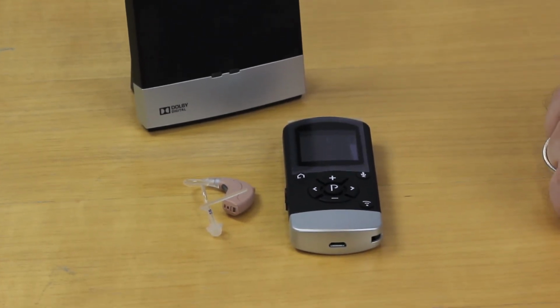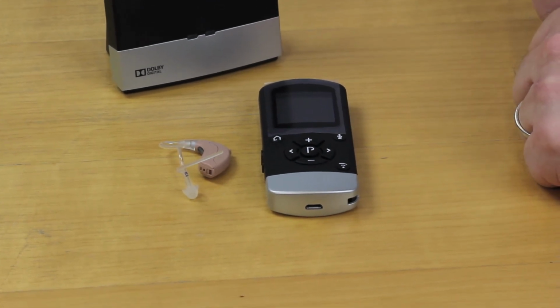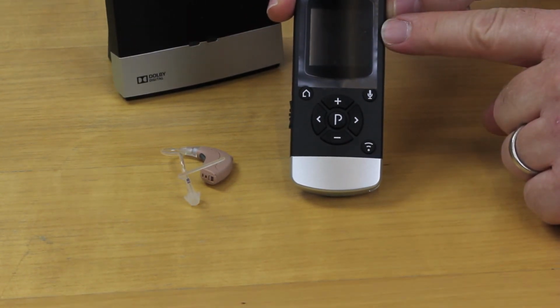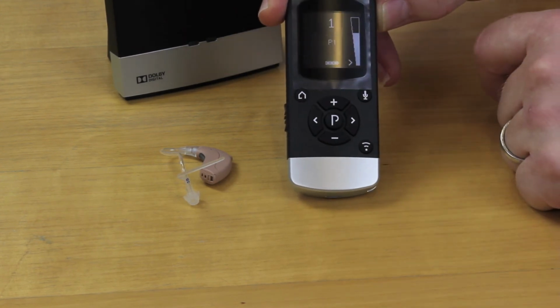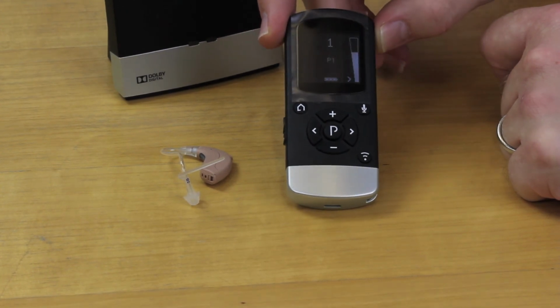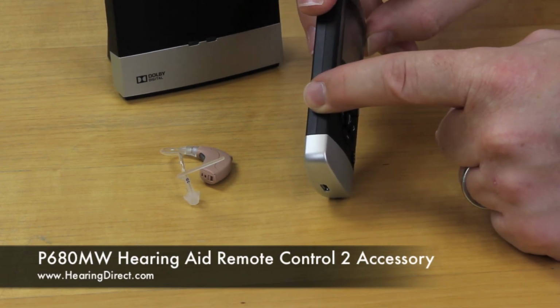The Remote Control 2 has a standby feature that puts it into a sleep mode after 20 seconds of non-use. Whenever the display is dark, simply press any button on the keypad to awaken the display and then perform the desired action. You may also wish to keep the remote control turned off to avoid unintentional changes if keeping the remote control in a pocket or handbag.